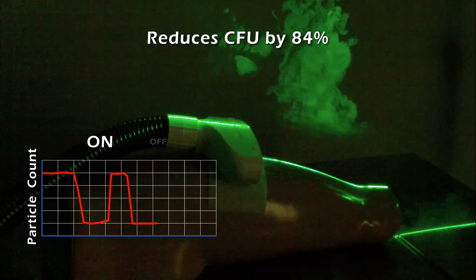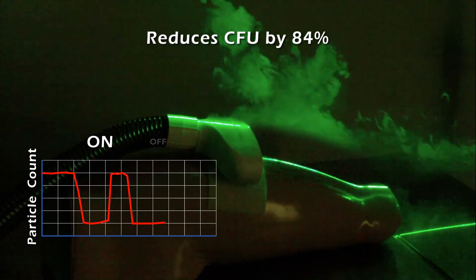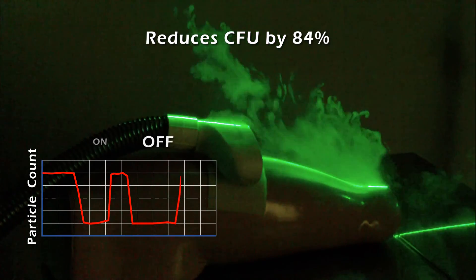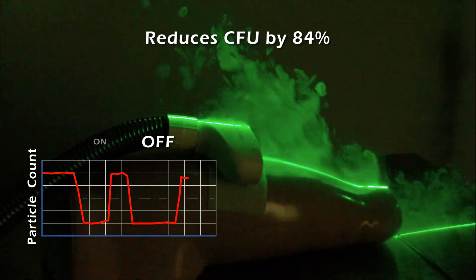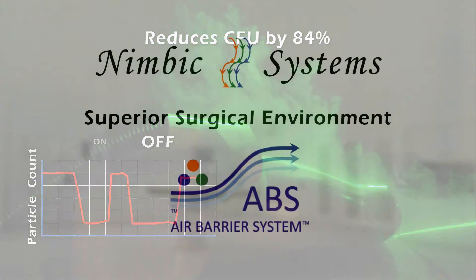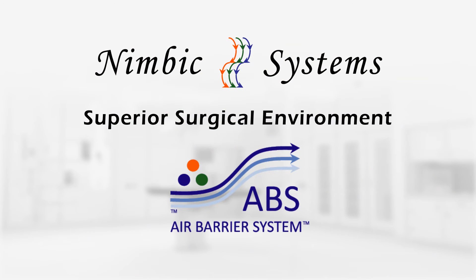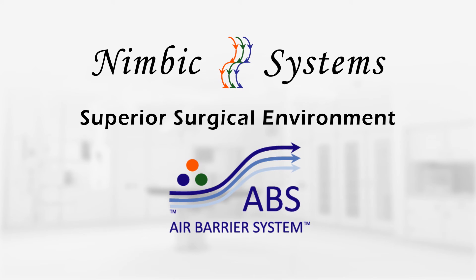By effectively shielding the incision site, the presence of potentially infection-causing organisms is greatly reduced. NIMBIC's Air Barrier System — The Superior Surgical Environment.